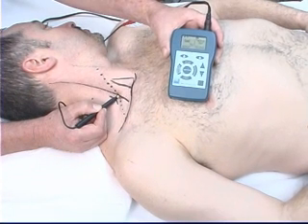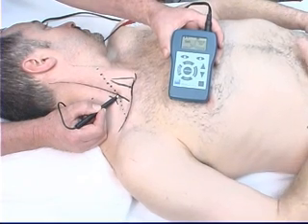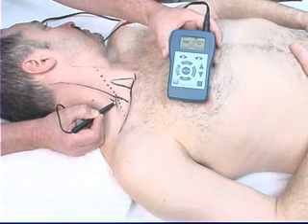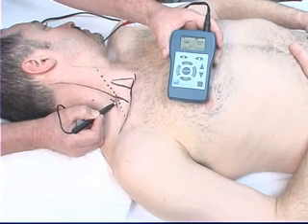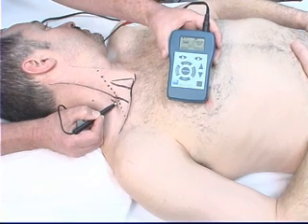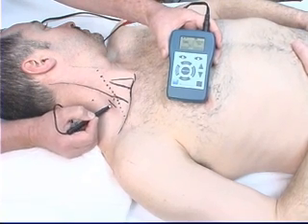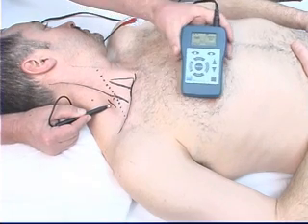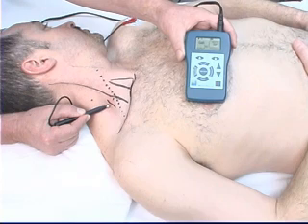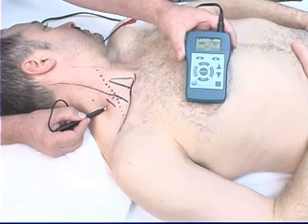The phrenic nerve is situated posterior to the sternocleidomastoid muscle at the level of the cricoid cartilage. Moving the probe approximately one centimeter posterior will stimulate the superior trunk of the brachial plexus and a biceps motor response will be evoked. Moving the probe approximately one centimeter further posterior will stimulate the dorsal scapular nerve, which innervates the rhomboid muscle.